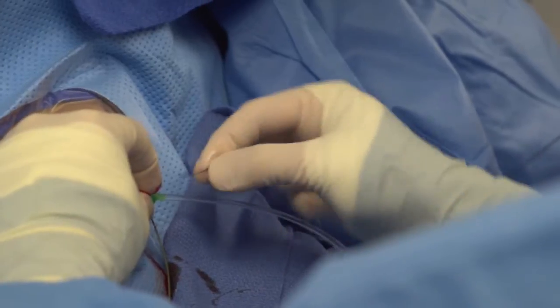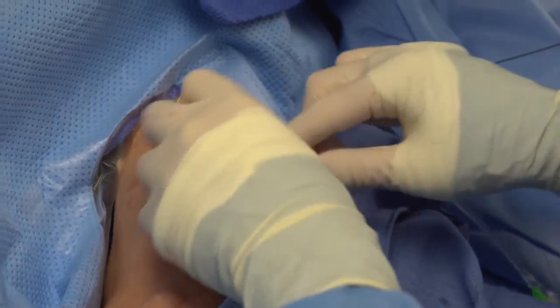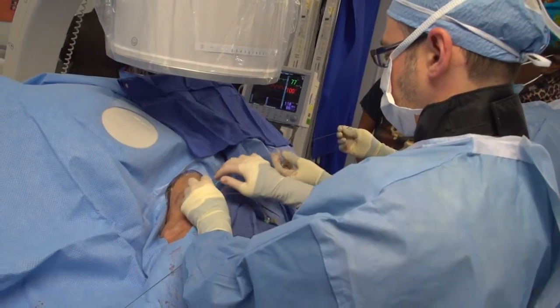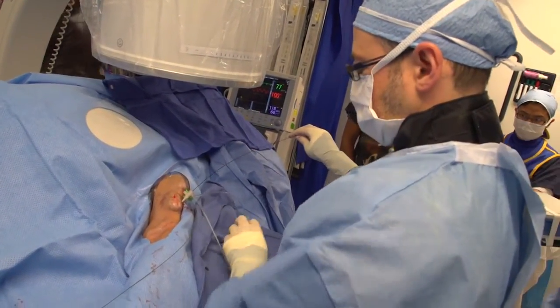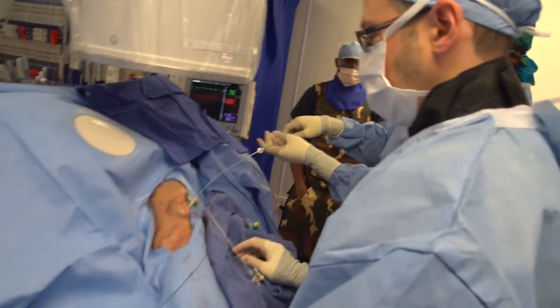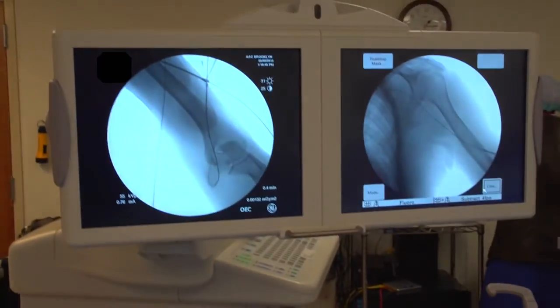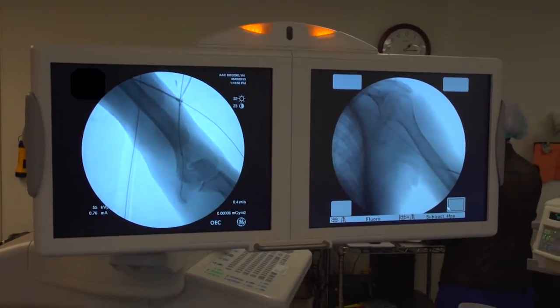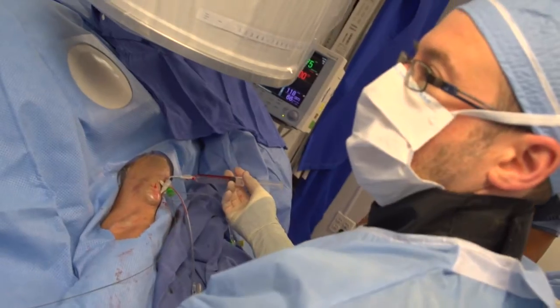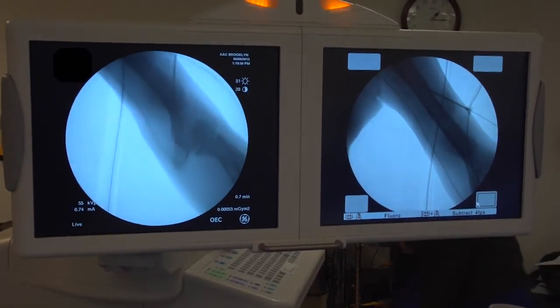We gain access toward the arterial limb of the fistula and place a five French sheath. If the procedure seems more complicated, I may place a seven French sheath for better control in case I need to place something like a covered stent. A diagnostic Berenstein catheter is then passed across the inflow and into the feeding brachial artery. We use fluoroscopy to ensure all procedures are done correctly, and perform a full arteriogram with extremity angiography all the way down to the palmar arch.